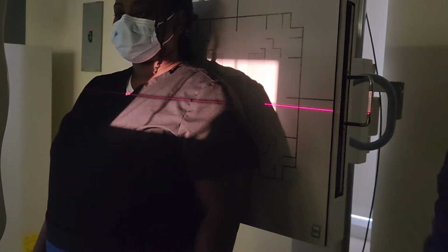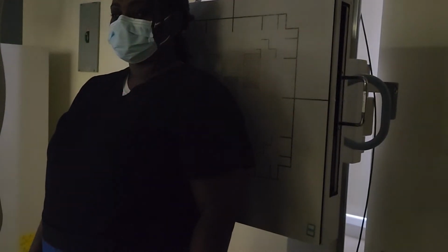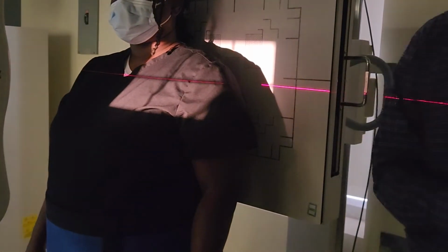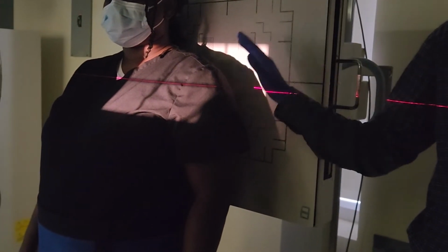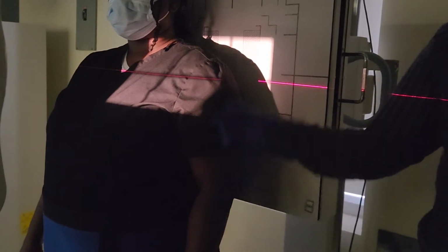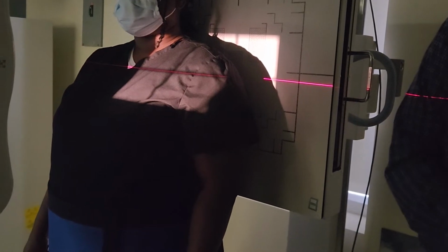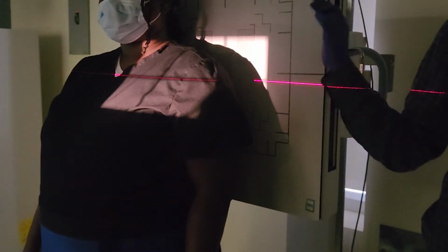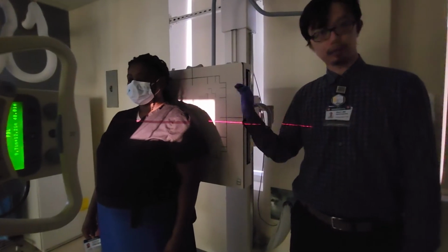Okay. Now, from here, with this centering, you can actually do 3 types of shoulder x-rays. You can do neutral rotation shoulder. This would be your trauma view. So patient has shoulder trauma, you don't want to move the arm, you leave it hanging straight down. This is your neutral rotation shoulder, right? Basically, palm against the leg. This is not something you want to do routinely. This is only for trauma when the patient cannot turn the arm.